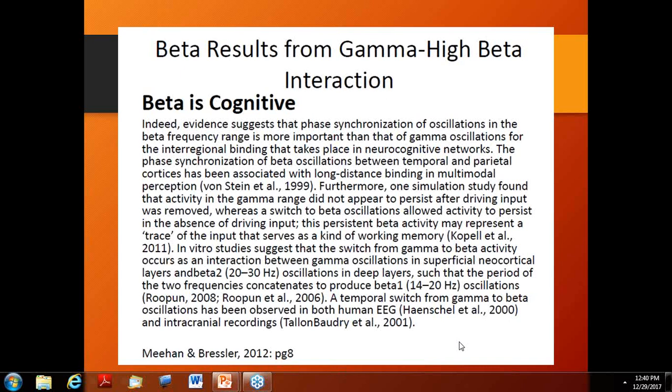So let's say you had one region, the anterior cingulate, that was heating up a lot and producing a lot of activity in the orbital frontal region, and that orbital frontal anterior cingulate group, which is one of the networks, FP1, FZ, was really heating up.